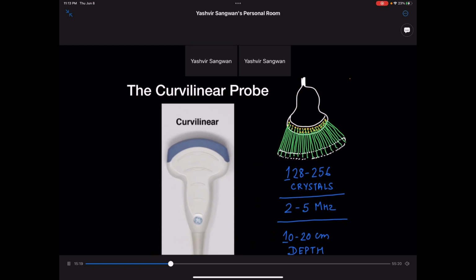The curvilinear probe is designed to give a big view of big organs, including the spleen and the liver and the kidney behind it, the uterus, the aorta, so on and so forth. Here we are not looking for lateral resolution or axial resolution because these are big organs. We are not looking at really small points. So you have somewhere around 128 to 256 crystals.